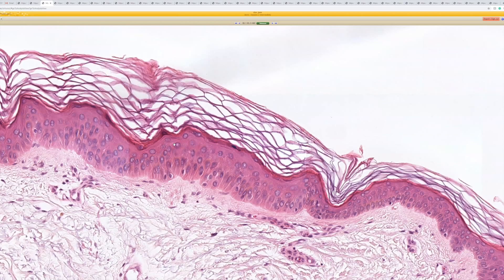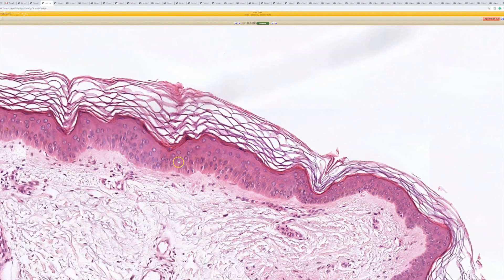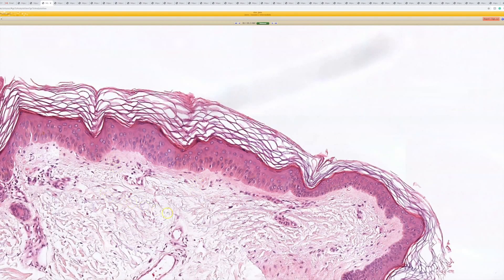Some people call these large cell acanthoma. I've always conceptually thought of these as basically solar lentigo with big cells — a simple way to remember them — because they have features that look like a flat seb, macular seborrheic keratosis, or solar lentigo, but the cells are quite a bit larger. Sometimes I also see solar lentigo and pigmented actinic keratosis intermingle together in the skin.